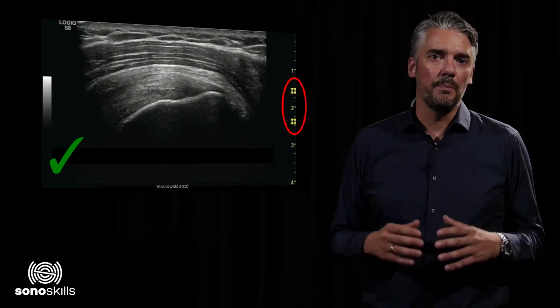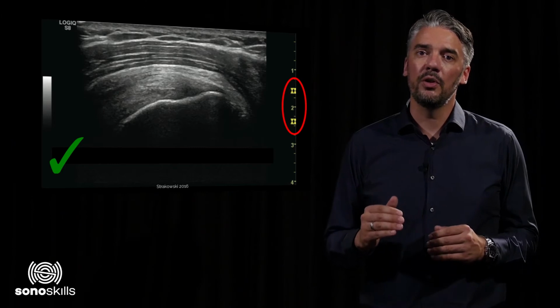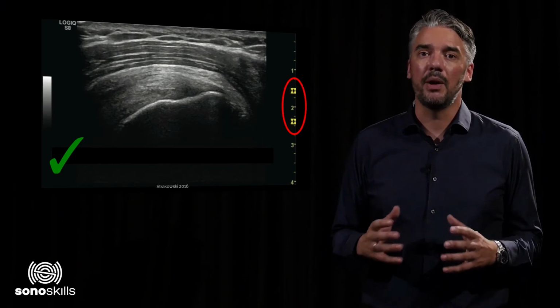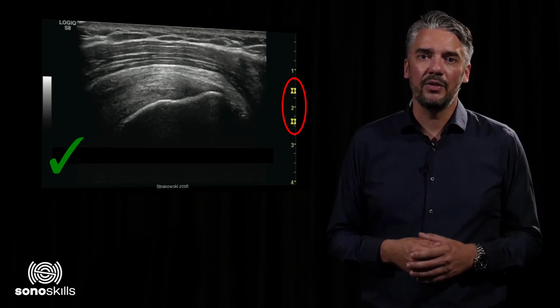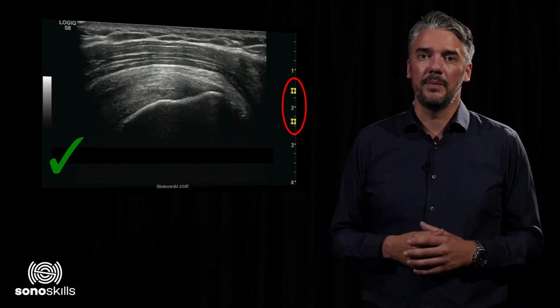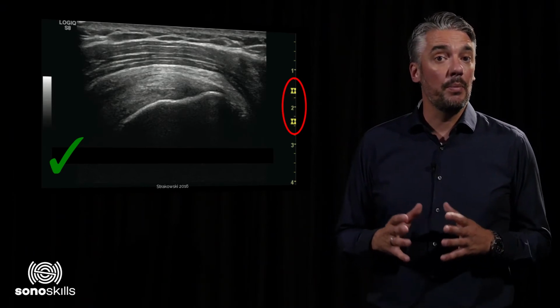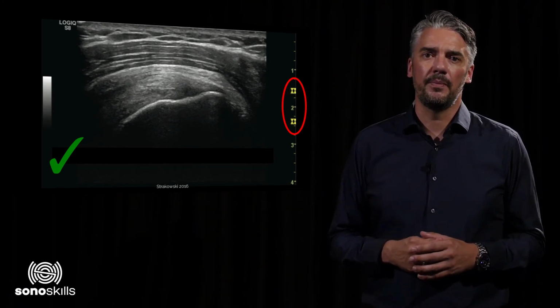However, where most people get unstuck is the positioning of the focal point when scanning a structure that is much wider in the plane parallel to the ultrasound beam. For example, if it has a significant depth on screen. Intuitively, most people will position the focal point at the midpoint of such a structure.